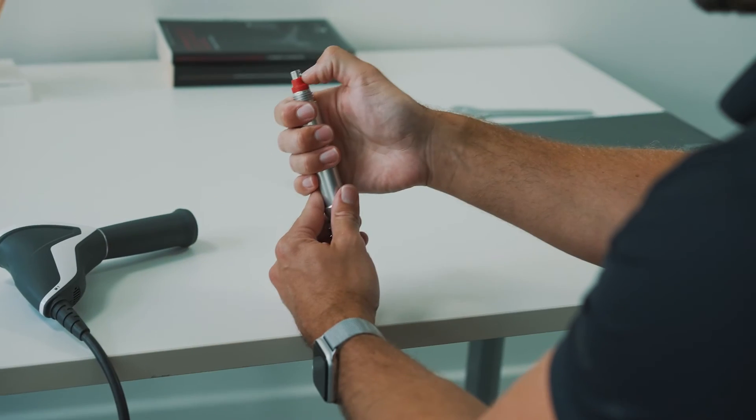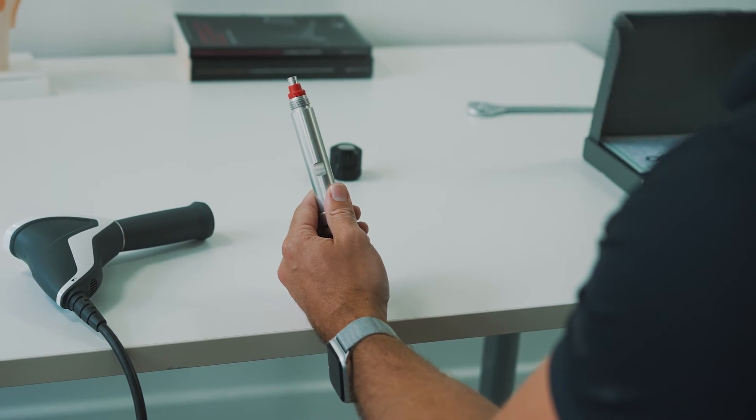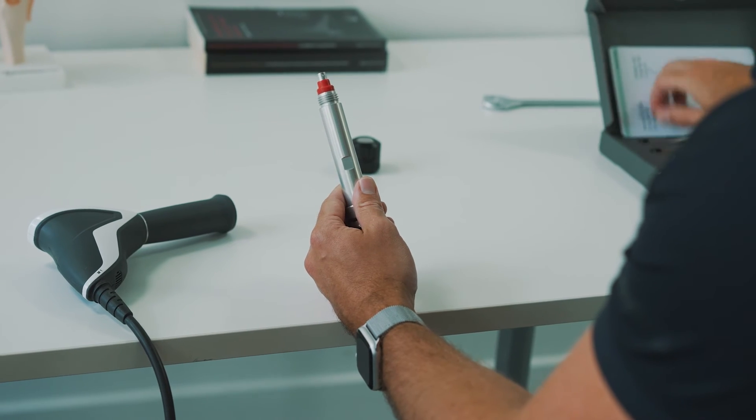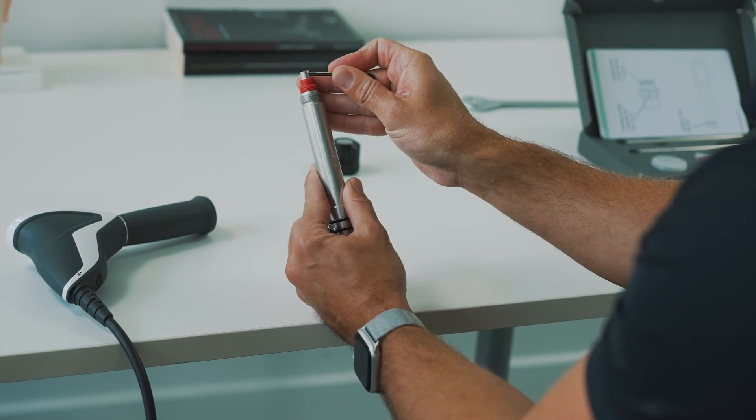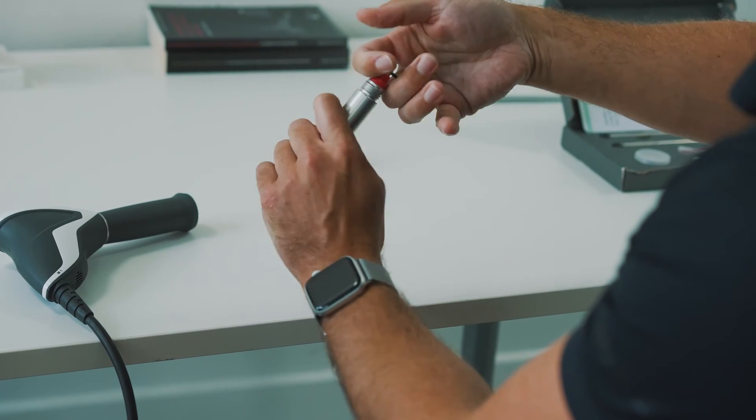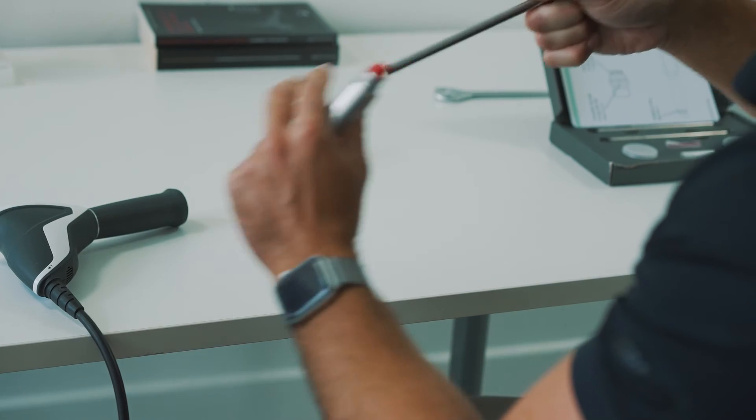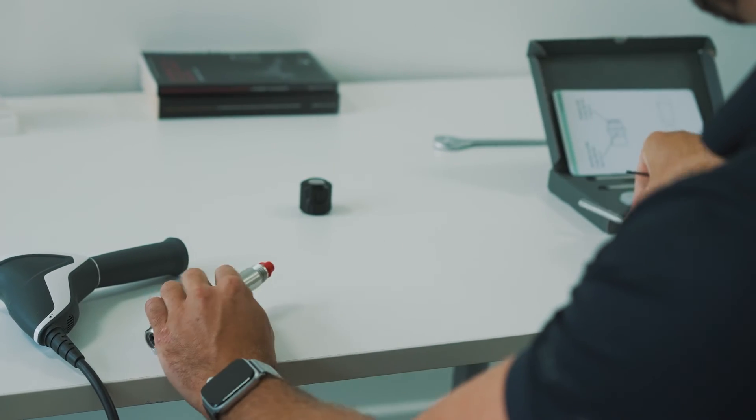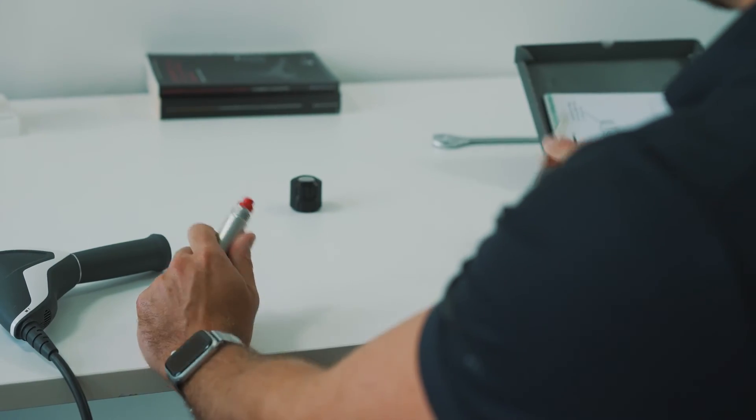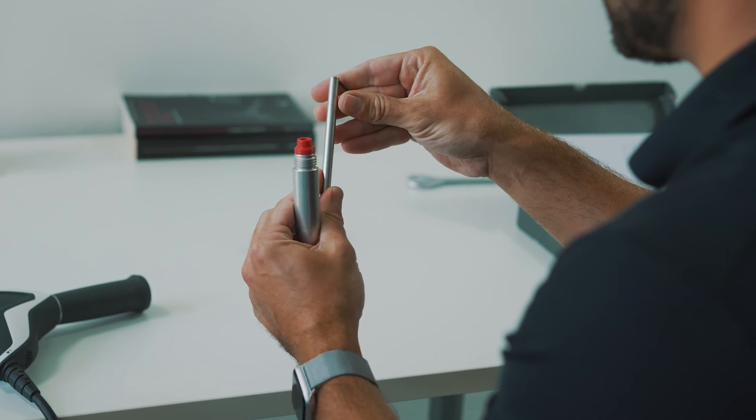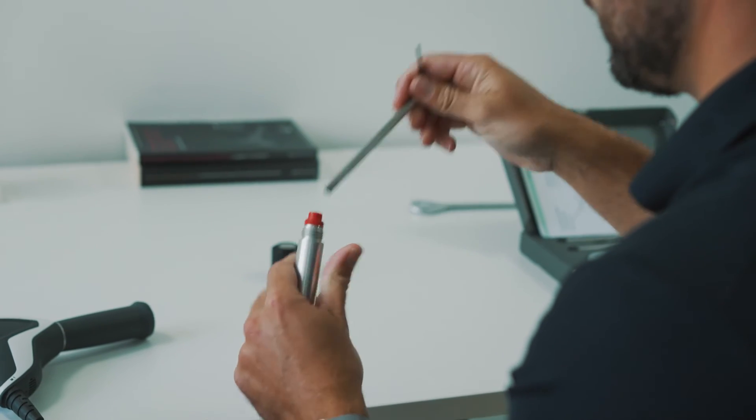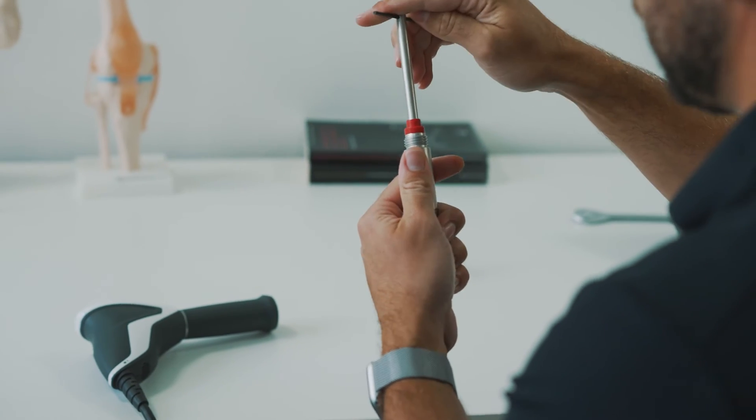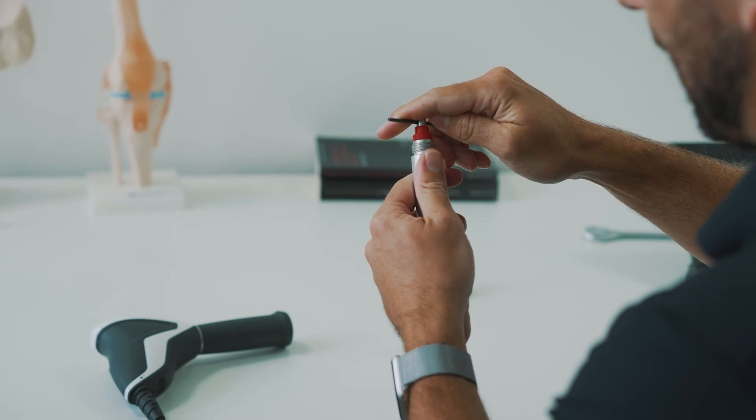To change the guide tube on the barrel, use the allen key to remove the guide tube. Insert the allen key through the hole and using a pulling and twisting motion, remove the old guide tube. Using your new guide tube, insert the allen key through the holes and then push the guide tube into the barrel, ensuring it's pushed all the way down.